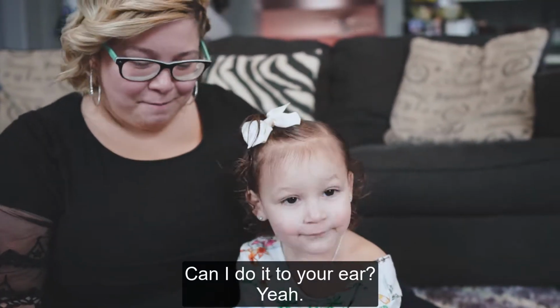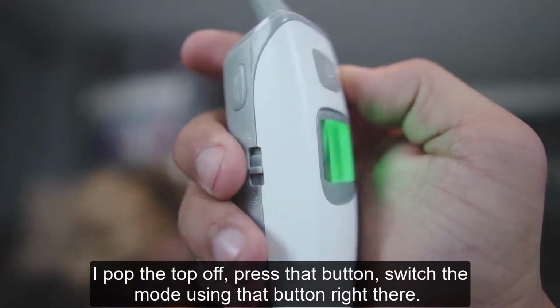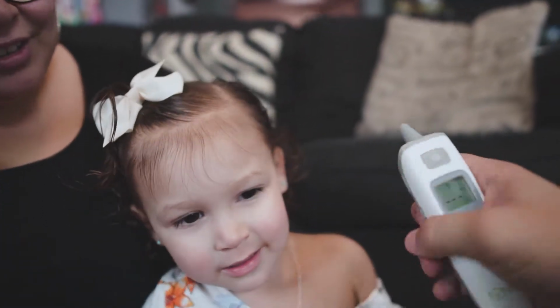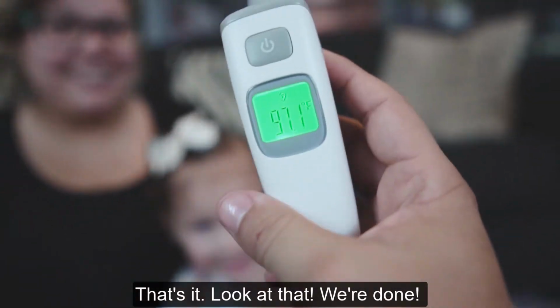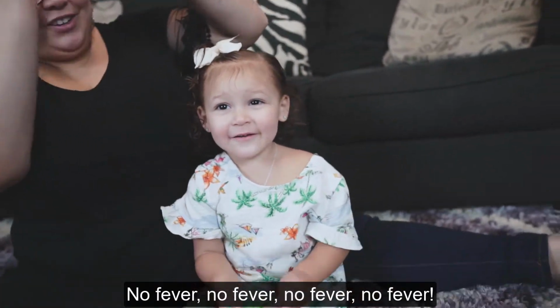Can I do it to your ear? Yeah. I pop the top off, press that button, switch the mode using that button right there. There it is. It's now in the ear. Show daddy your ear. Ready? Wow. That's it. Look at that. Bam! We're done. Yay! No fever.